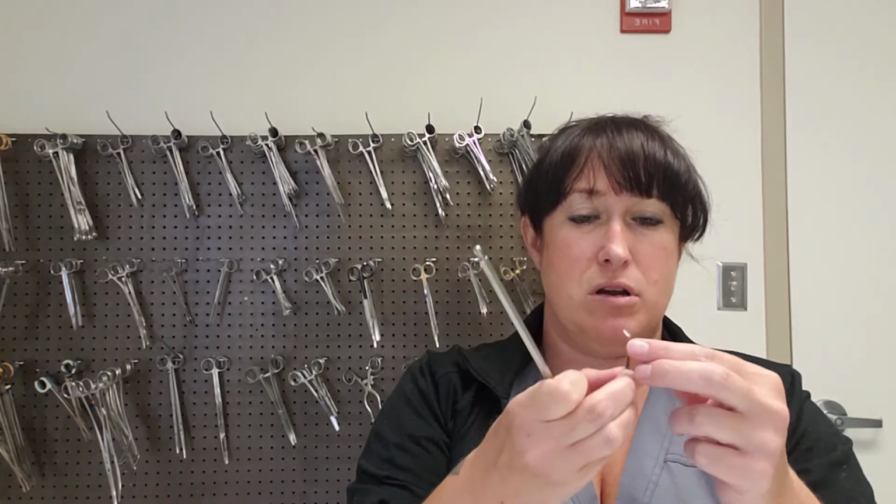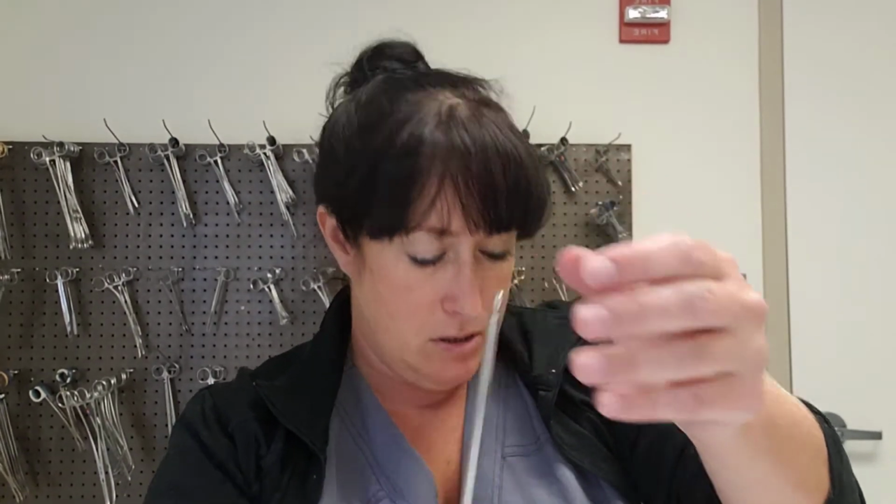And then this beaver blade, how do you put it on there? See, I've got this really funky one that's intended for eyes, but like I said, the 69 one, which is straight like this but straight up and down, that's going to be what you're going to be more familiar with. But when you do put it on here, make sure this thing is unscrewed pretty good, because if it's not, it makes it really hard to get on there. And then you can grab this, because the sharp part's at the end. You can grab this with your needle holders, and then you're going to have to very carefully put this in here.